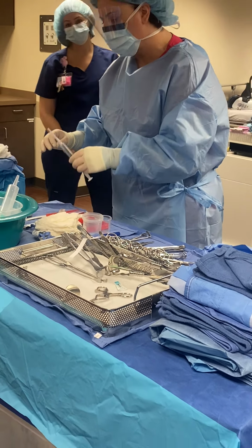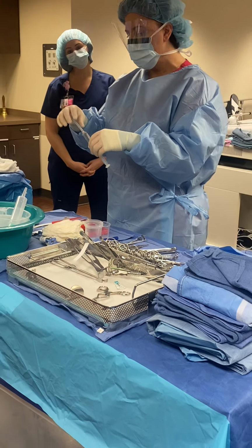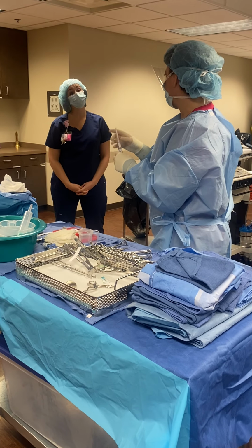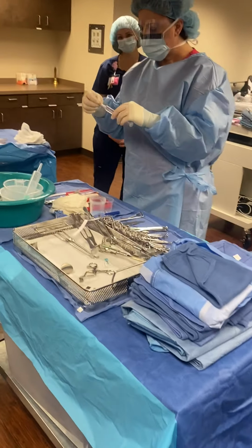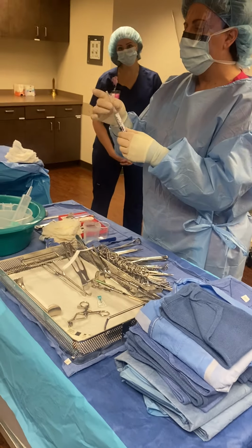Single-handed scoop, you never want a two-hand on the hypo. So maybe that's another station we could add, just a couple syringes and hypos, so they could practice with that. And then push it on.